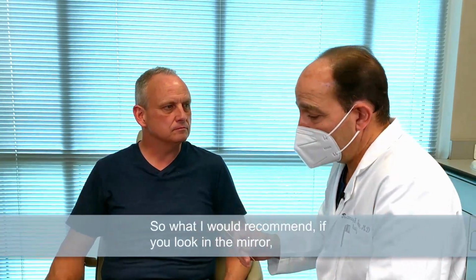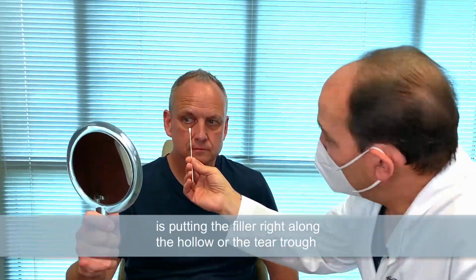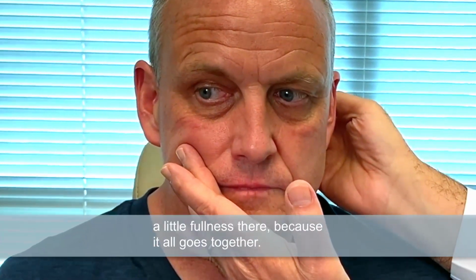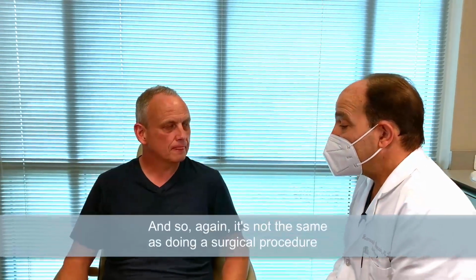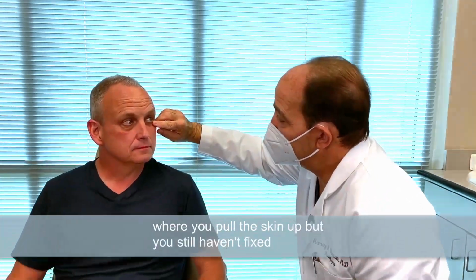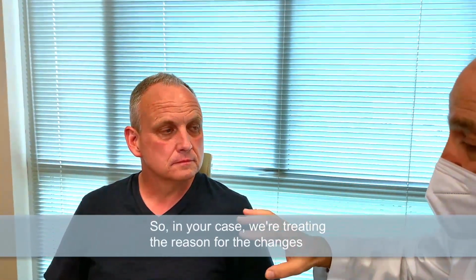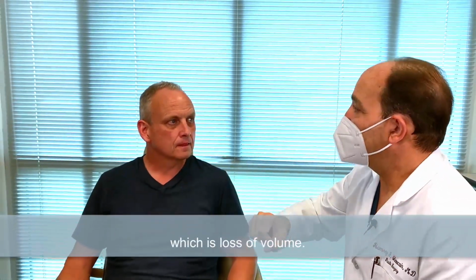So what I would recommend, if you look in the mirror, is putting the filler right along the hollow or the tear trough, and then putting a little bit here just to give you a little fullness there, because it all goes together. And that's what I would do. All right. Okay. And so again, it's not the same as doing a surgical procedure where you pull the skin up, but you still haven't fixed the hollowness even if you pull the skin up. So in your case, we're treating the reason for the changes, which is loss of volume.